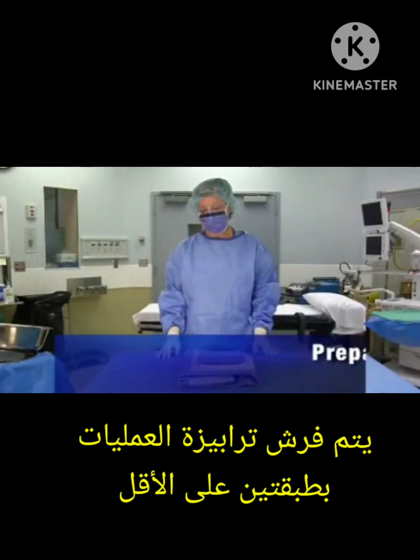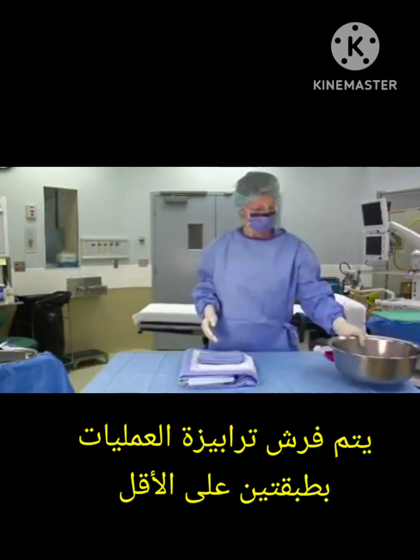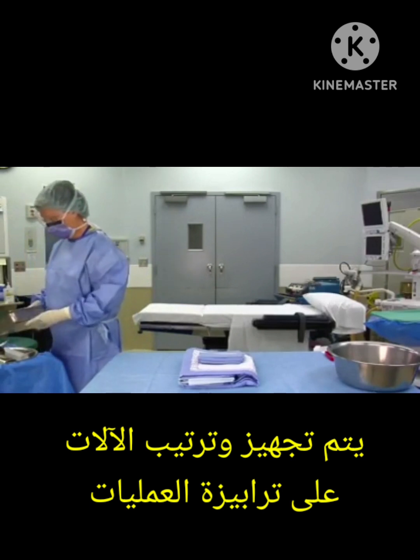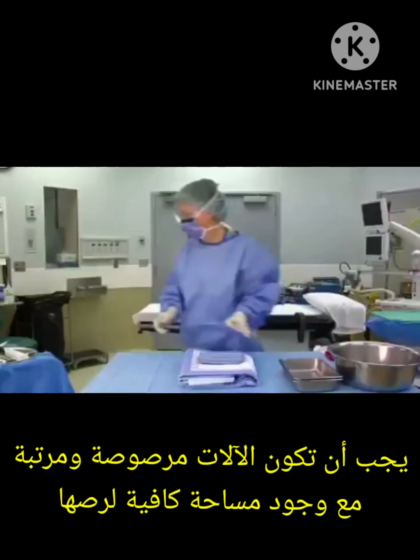Begin by placing the basins where they will be used. Handle instruments and supplies in an organized and systematic manner. Use the principles of effective body mechanics and economy of motion, moving items only when necessary. Ensure that your back table is neat and that you have a designated working space.